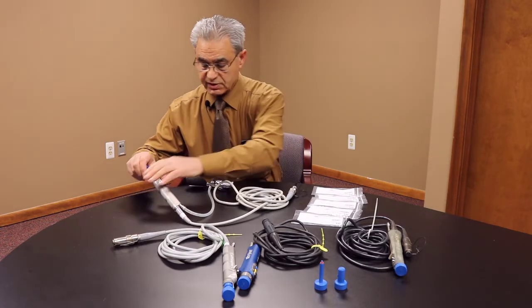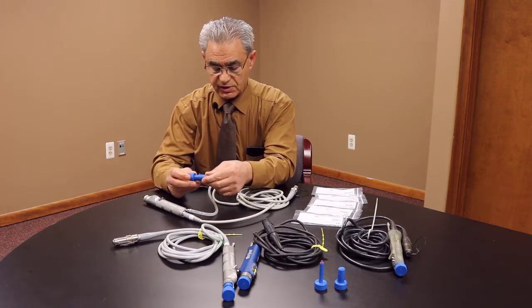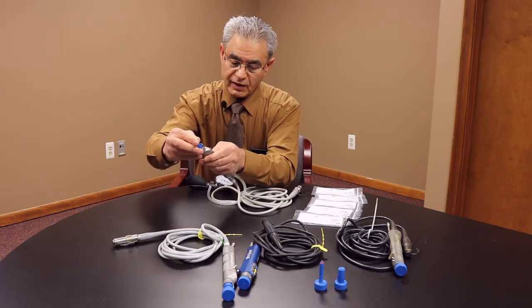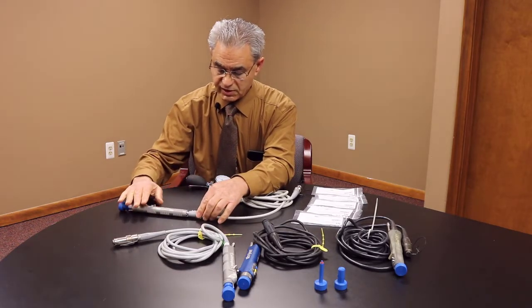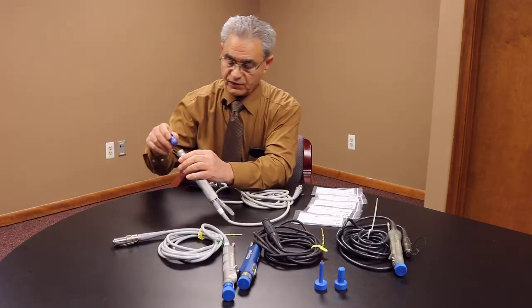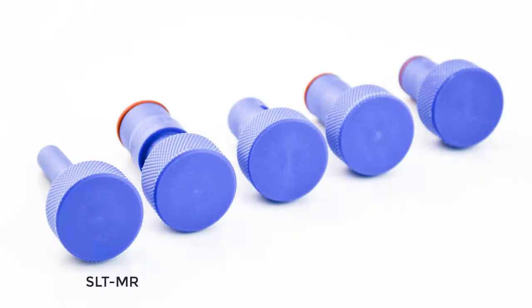So we came up with this shaver leak tester. Basically it works by blocking the end of the shaver, and while you do that you can actually test the integrity of the inside to see if the shaver is functioning correctly. It's a simple process. We have five different leak testers: for Midas Rex, Striker, Conmat, Dionic, and Arthrax.